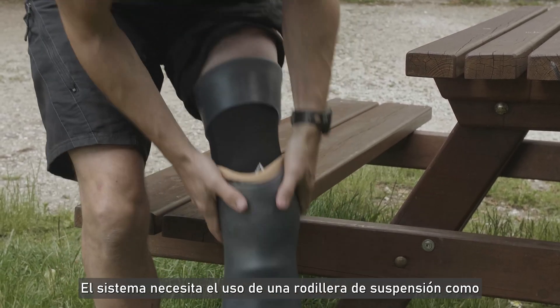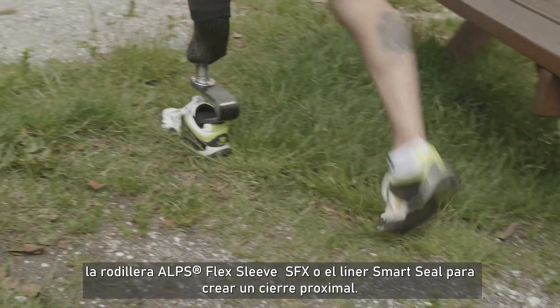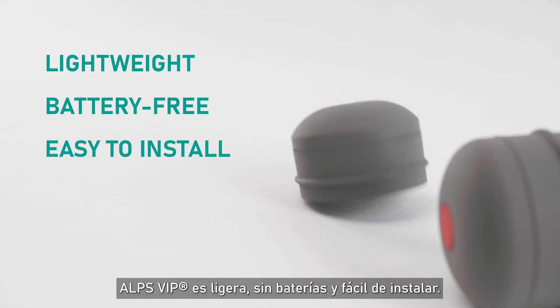The system requires the use of a suspension sleeve like the ALPS SFX Flex Sleeve or a Smart Seal Liner to create a proximal seal. ALPS VIP is lightweight, battery-free, and easy to install.